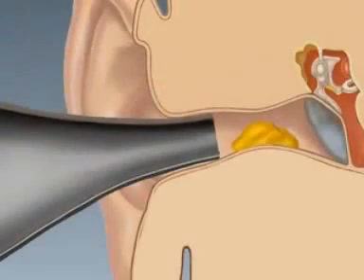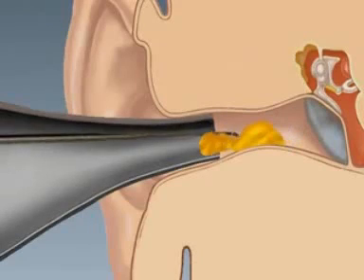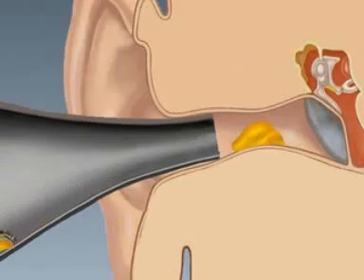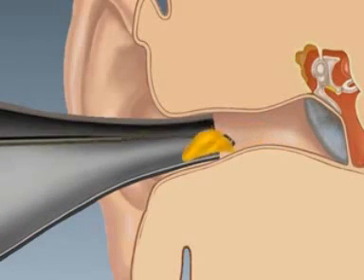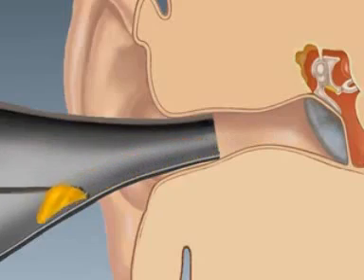Do not attempt to break through the cerumen, as this may result in further impaction. Rather, try to pass the loop of the curette behind the piece of cerumen, being careful not to traumatize the walls of the external auditory canal or the tympanic membrane with the curette.